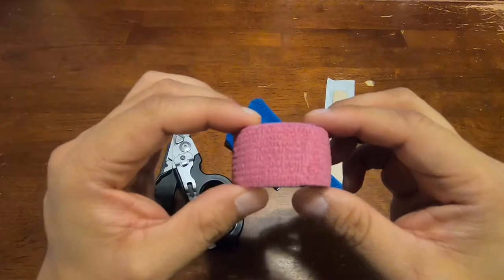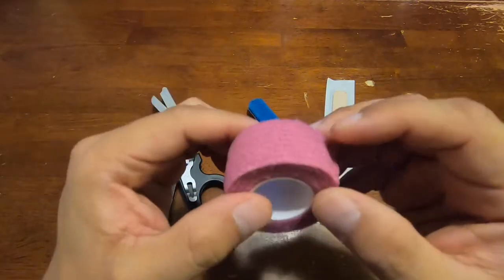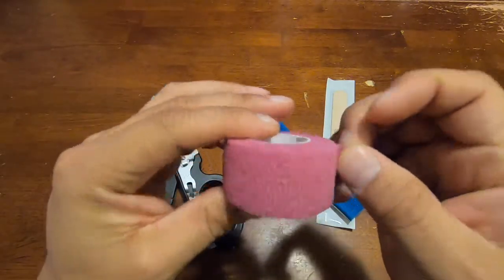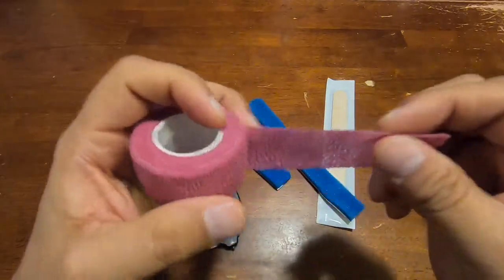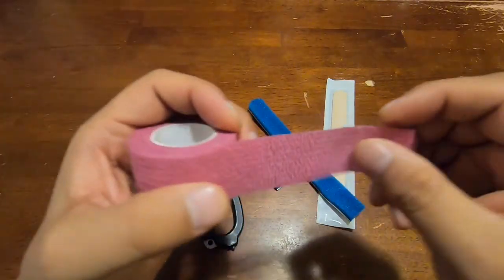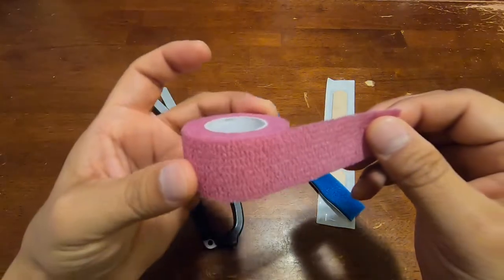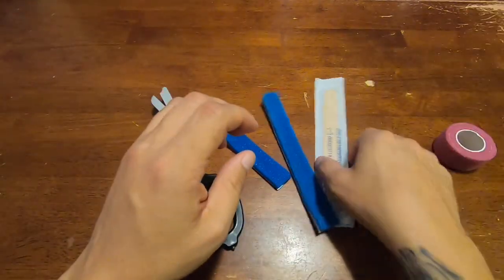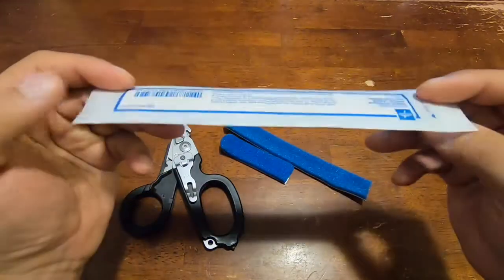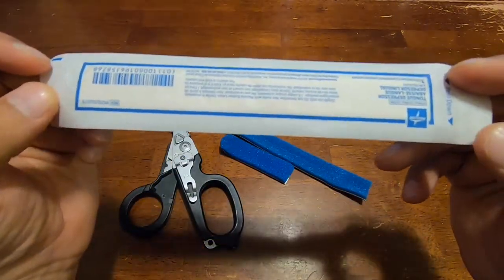So let's start. To begin would be what's called a Coban, or the off-brand name is Coflex. All it is is an elastic self-adhering bandage, sticks to itself, very durable, comes in different sizes.